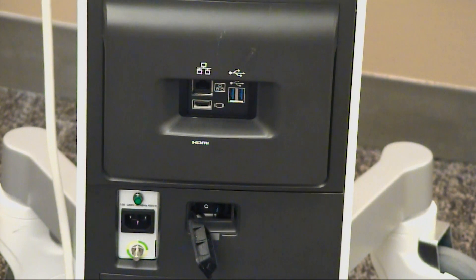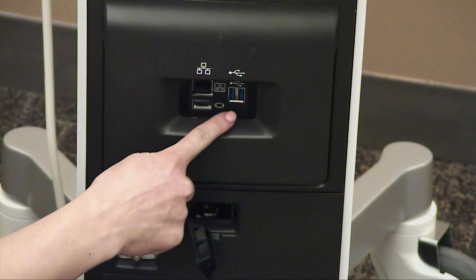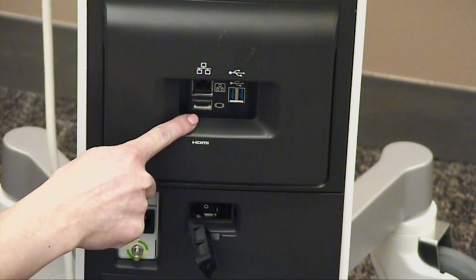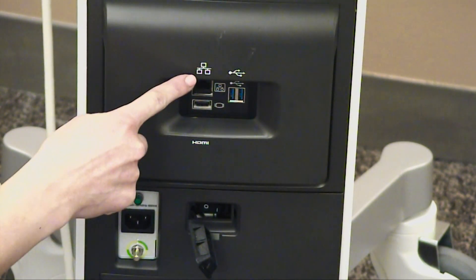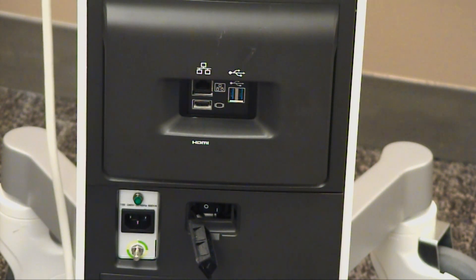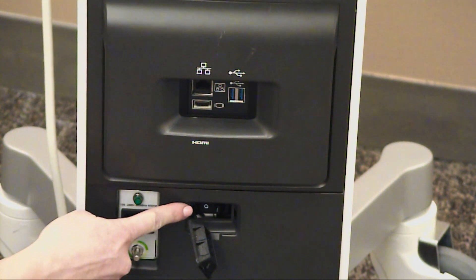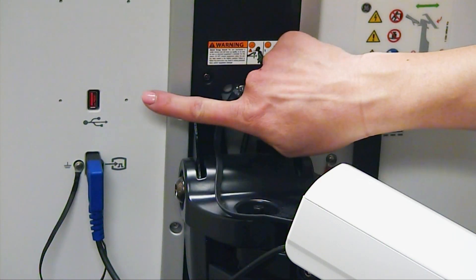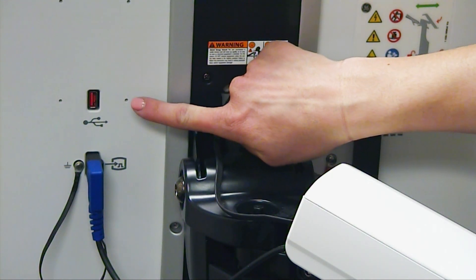In the back of your ultrasound system, you have available two USB ports, one HDMI port, and one ethernet cable port. You also have a breaker switch available to you located directly underneath. There is an additional USB port located on the back of the Venue's monitor.